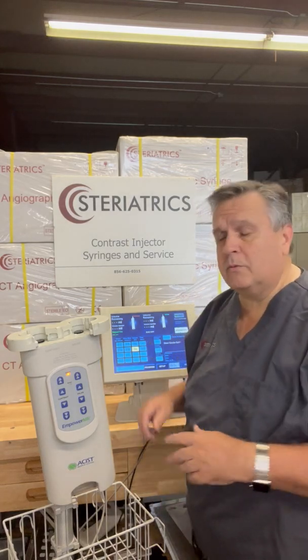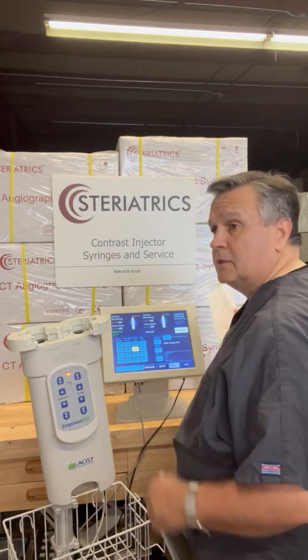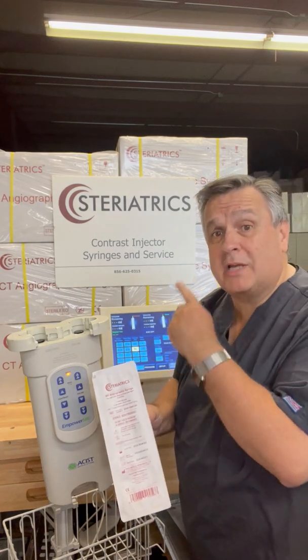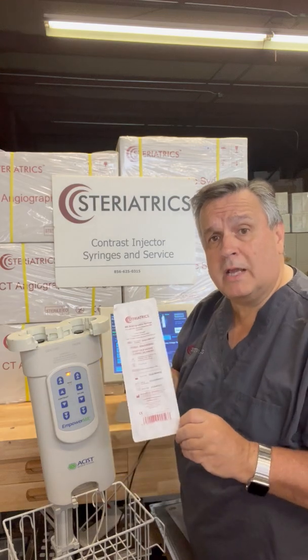Hi, it's Guy the Injector Guy coming here with the MPower MR injector and the Steriatrix B302 syringe kits that fit this injector. This is a great injector. I'm going to do another video on how much I actually like this thing and show you some of the key features of it. But for now, I'll show you how to use the syringes.